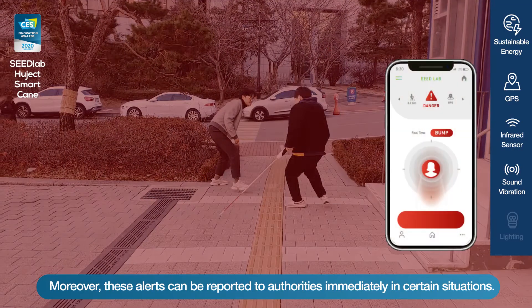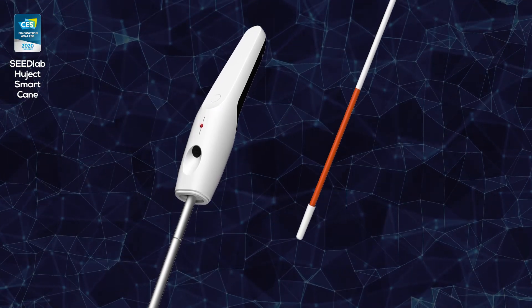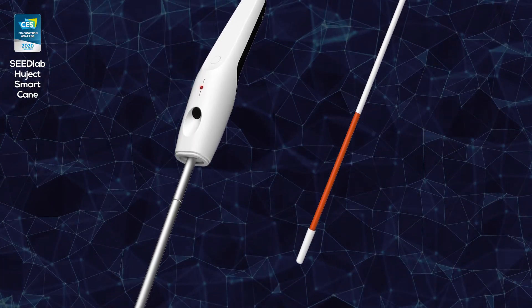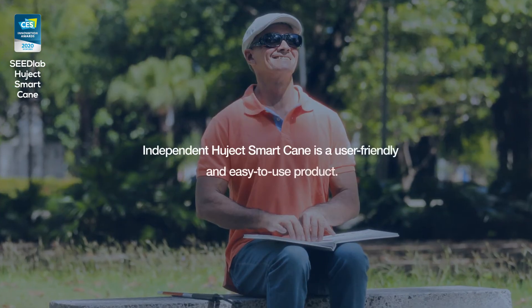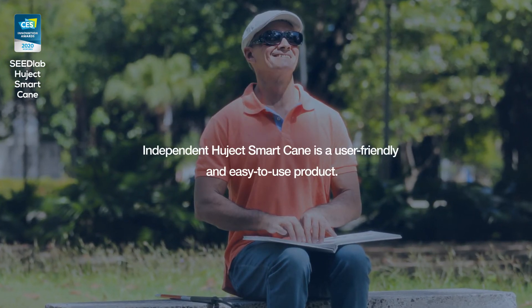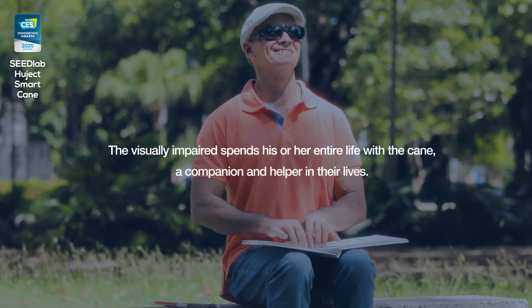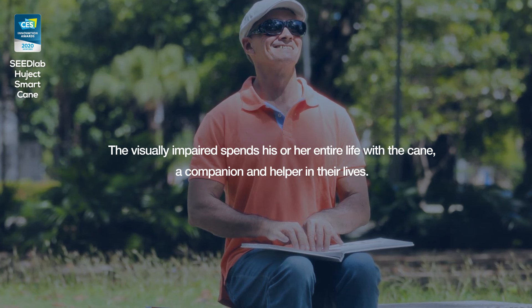Moreover, alerts can be given to a designated guardian or the visually impaired through a smartphone application, and these alerts can be reported to authorities immediately in certain situations. Huject Smart Cane is a user-friendly and easy-to-use product — the visually impaired spend their entire life with a cane as a companion and helper.